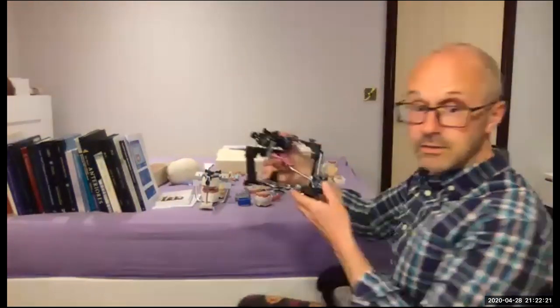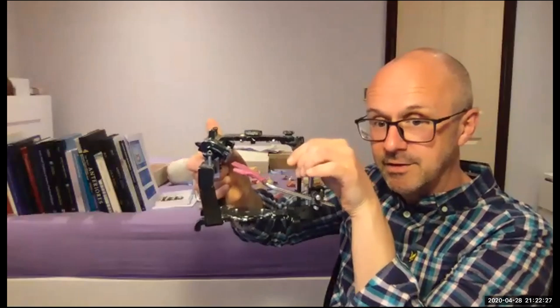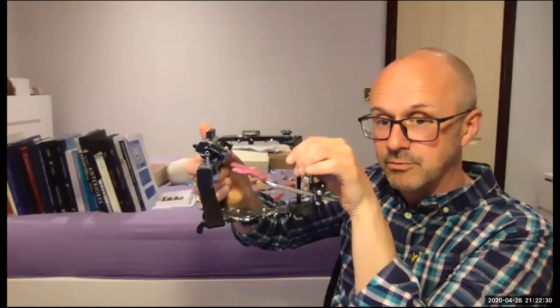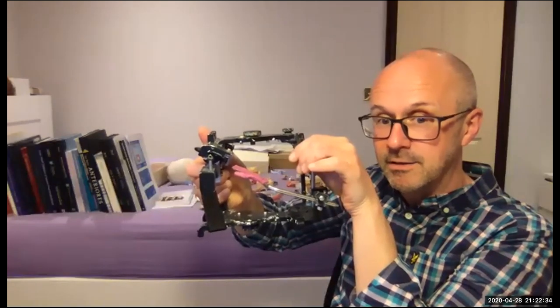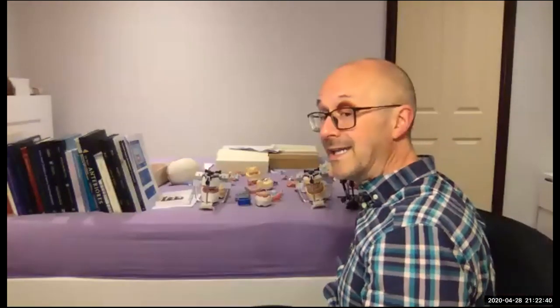Is the occlusion in centric relation for the metal overlay denture? I did that, we mounted the models in intercuspal position using a face bow, and then we just opened the bite up 2 millimeters at the incisal pin. Because we've mounted it using a face bow, we've got the hinge axis in the same position as the patient. So it's in intercuspal position, opened up, and then we made the denture at that increased vertical. So I didn't use CR for Wendy. It was ICP.